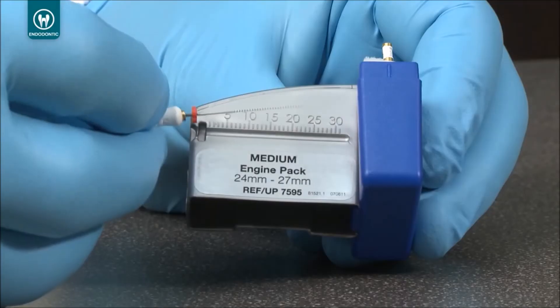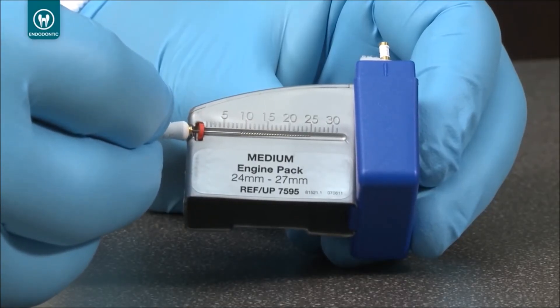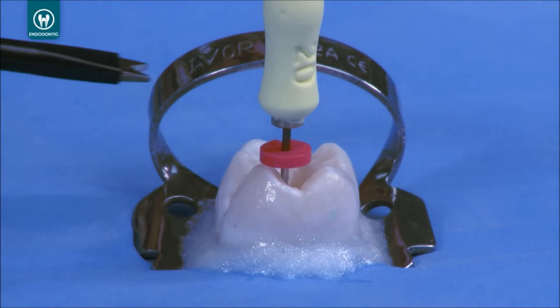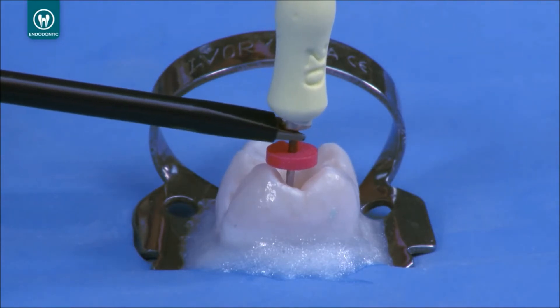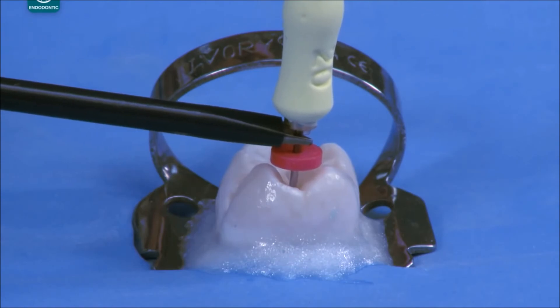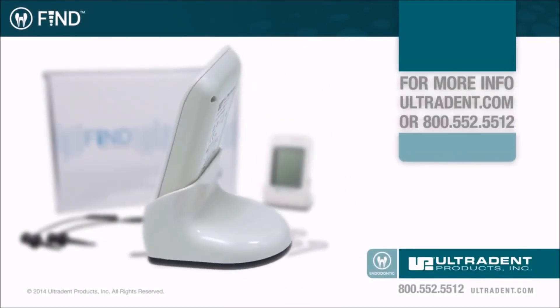Determine the working length using an endodontic ruler. To establish the working length, subtract 0.5 to 1 mm from the electronic length. The operator can check the position of the file any time during instrumentation using the touch probe — simply touch the probe to the file while the file is in the working length position. The EndoEase Find Apex Locator: Simplifying Endodontics.